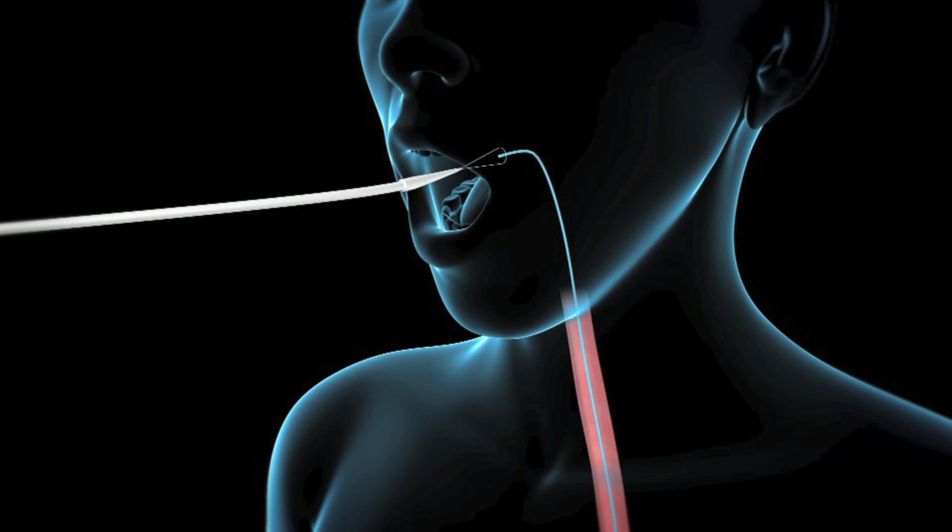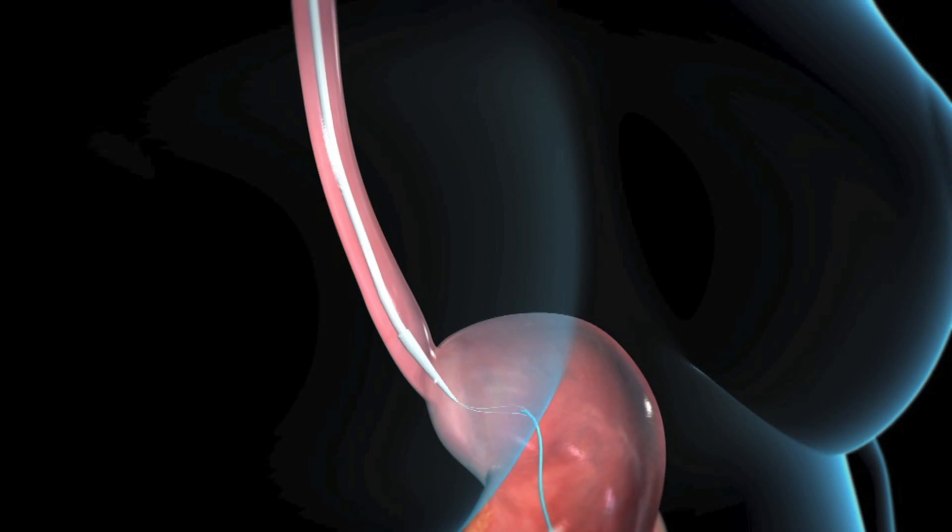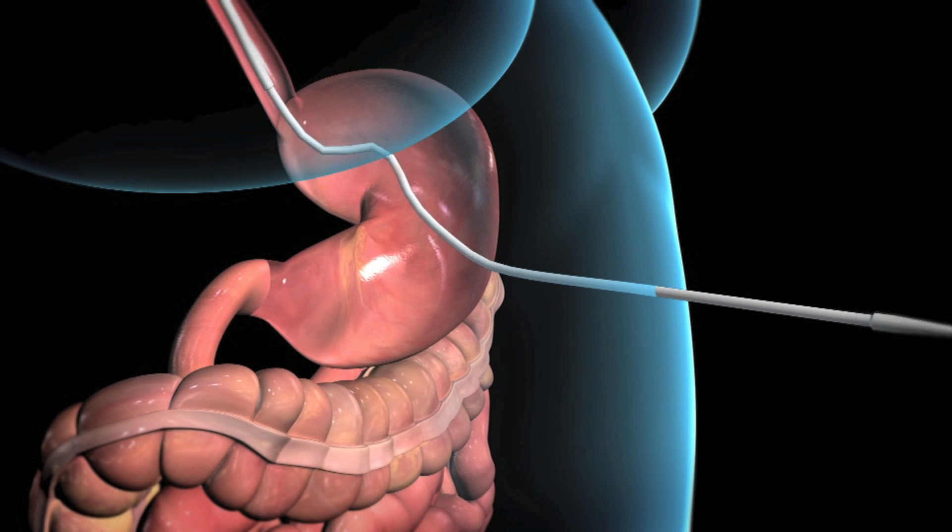Your doctor will attach the A tube to the wire outside of your mouth. By gently tugging on the other end of the wire, he or she will pull the tube back through your mouth and esophagus and into your stomach.